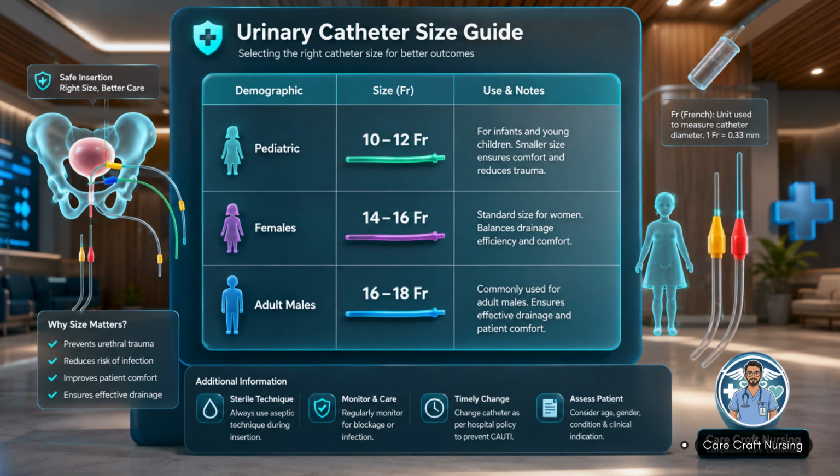Now, a completely crucial point for both your clinical exams and your daily floor practice is memorizing these specific sizing guidelines, which are measured in French units. Pediatric patients are going to need smaller sizes, usually around 10 to 12 French. For adult females, the standard is typically 14 to 16 French, and for adult males, mostly just due to anatomical differences, we generally step up to 16 to 18 French. Hitting the nail on the head with the correct size is essential. It maximizes patient comfort and, more importantly, prevents urethral trauma.